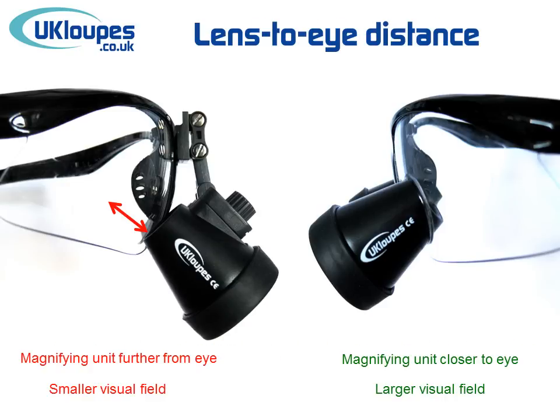Another difference between flip-up loupes and TTL loupes is that the lens is positioned further away from your eye in flip-up loupes. This is shown in the picture. The closer the lens is to your eye, the greater visual field will be viewed through the loupes.